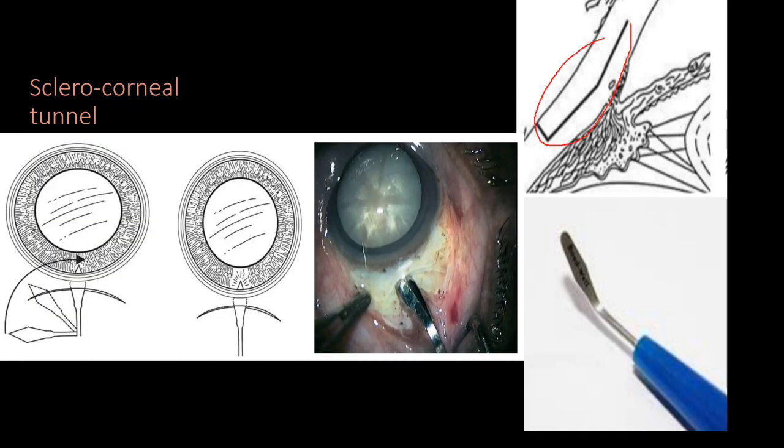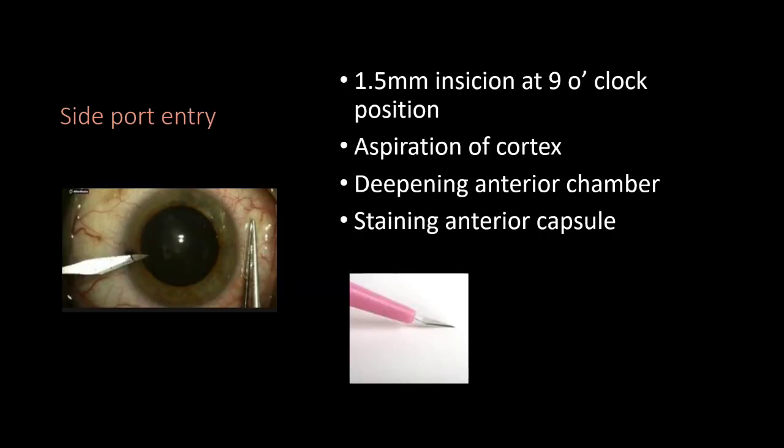Next, we make the sclerocorneal tunnel using a crescent blade, entering 1 to 1.5 mm into the clear cornea. After the sclerocorneal tunnel, we create a side port incision using a lance blade at 1.5 mm size.